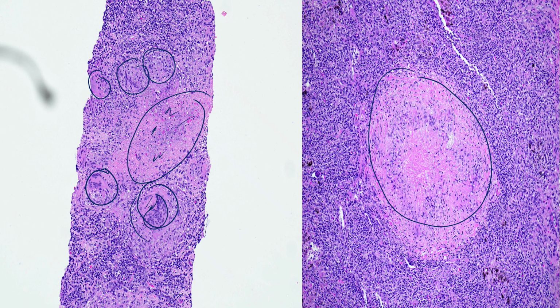But go forward, take some higher magnification, take the help of it, study the cells properly. But just by the look of it, it looks like tuberculosis. Yes, it can be another granulomatous inflammation as well. It can be another disease which can cause granulomatous inflammation. But because we are living in India, tuberculosis should be highly suggestive. Nobody can be 100% sure of TB unless proven otherwise.